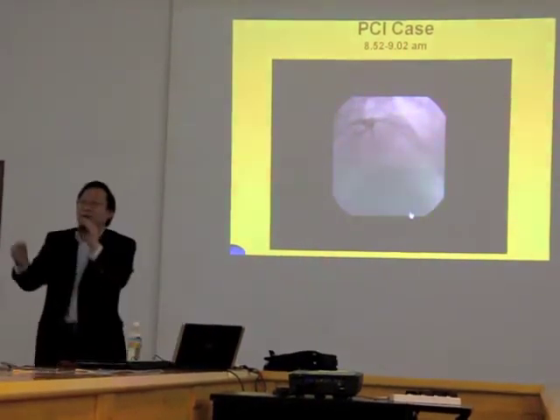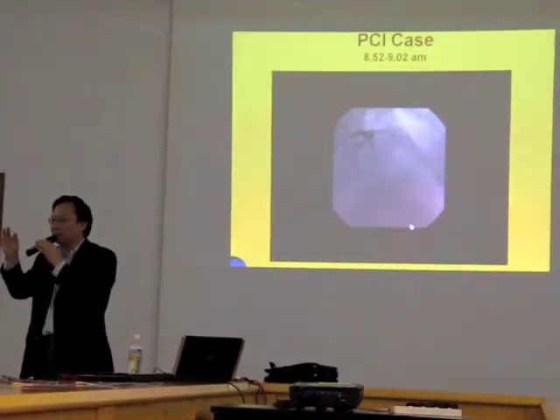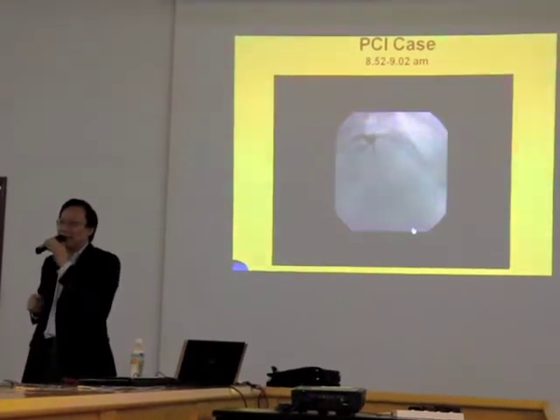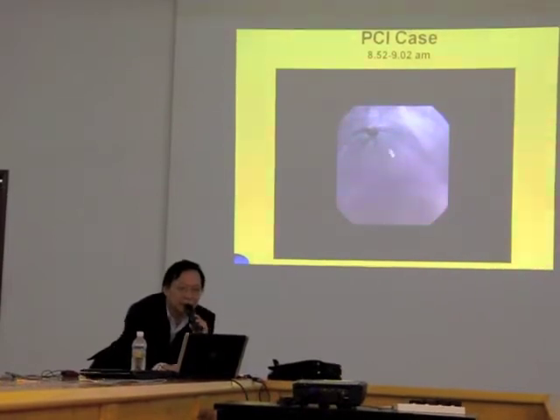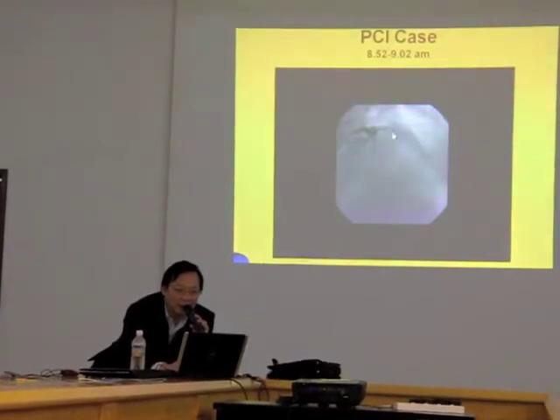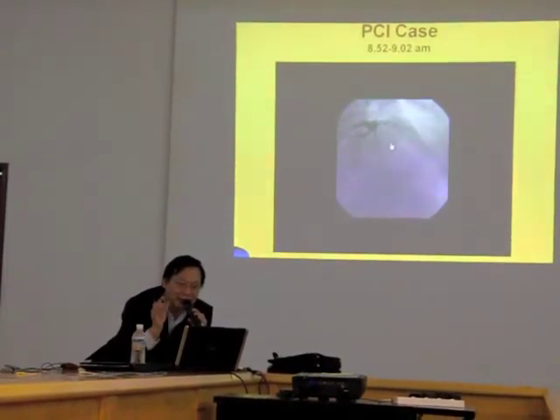Now, what do I do next? I put a stent there. This lesion is about 80% and looks very smooth and soft, so I can put a stent immediately without using a balloon to dilate the artery first. This is the stent — placed across that narrowing. I'm doing an injection to make sure the stent is in the correct position.